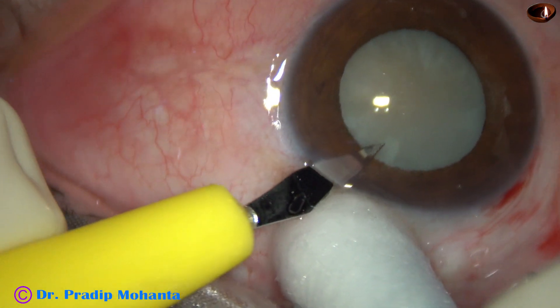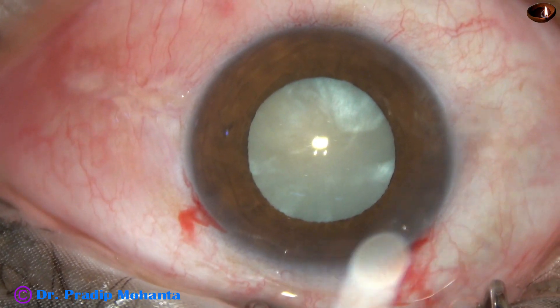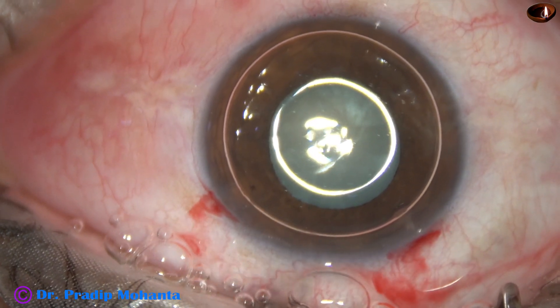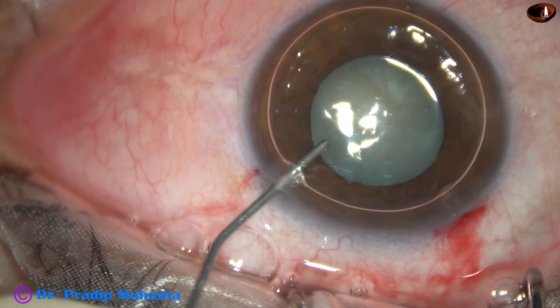By this time, the main incision and a side port has been made. Now I inject an air bubble. And beneath this air bubble, trypan blue 0.06% dye is applied over the anterior capsule.